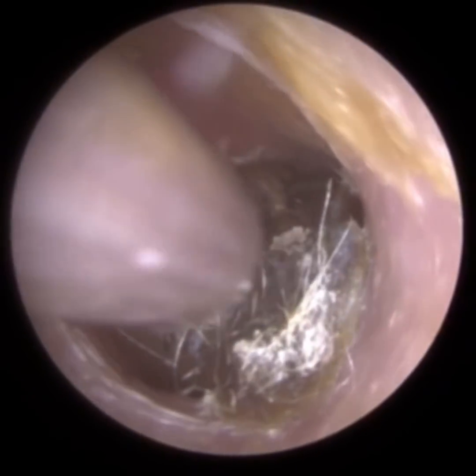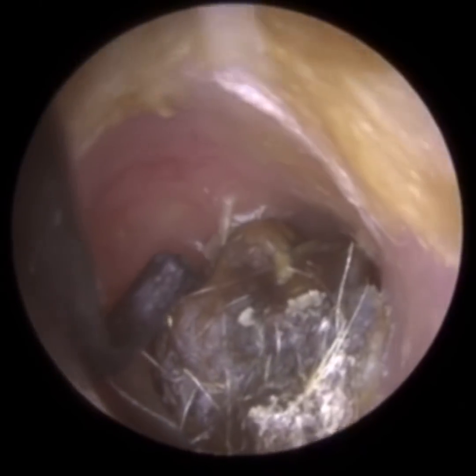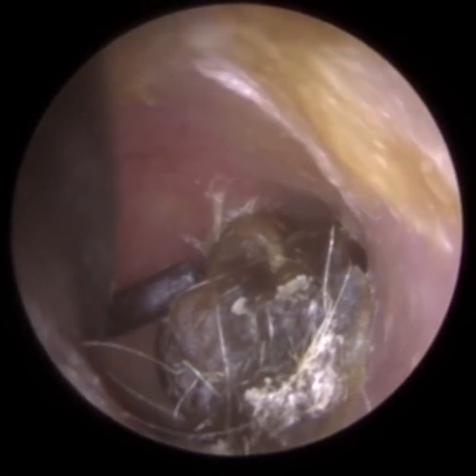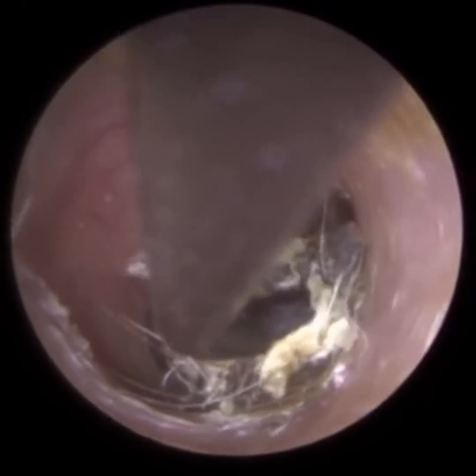Although I'm using suction to start off this procedure, it was very apparent almost immediately that it's not going to work. The wax plug was very dry and very embedded.